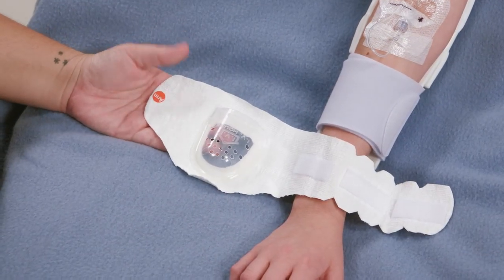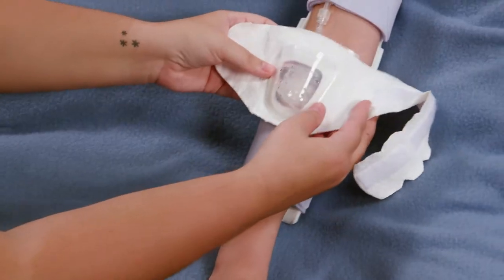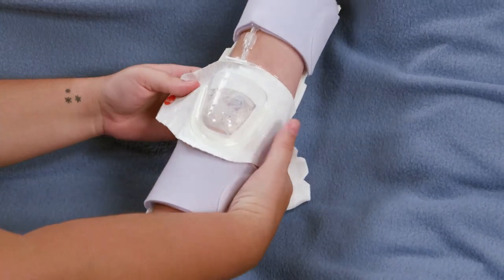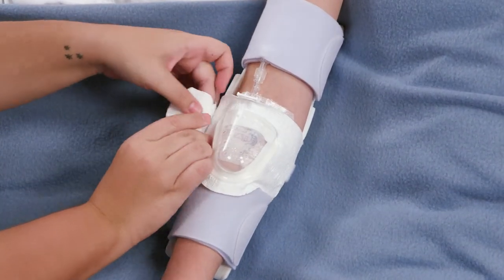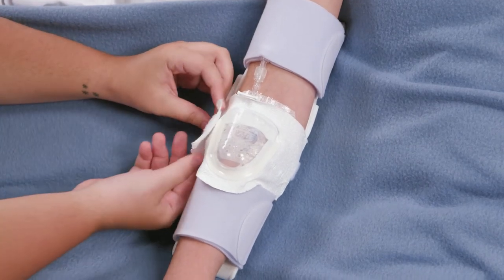To use the 730 arm model, protect the loop of tubing and catheter with the plastic dome. Position the clear, ventilated plastic dome over the looped tubing and catheter hub, with the round edge of the dome pointing toward the hand. Wrap the adjustable strap comfortably, leaving enough stretch to fit a finger under the fabric.